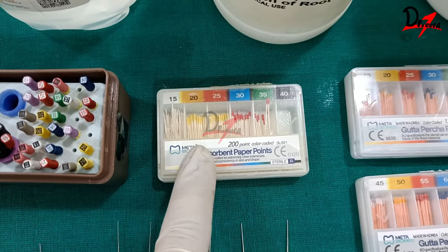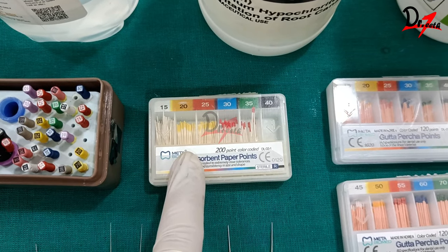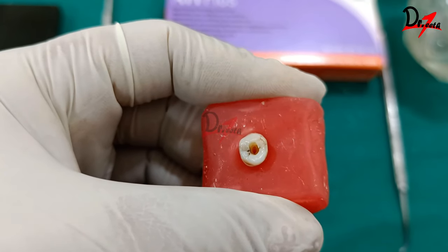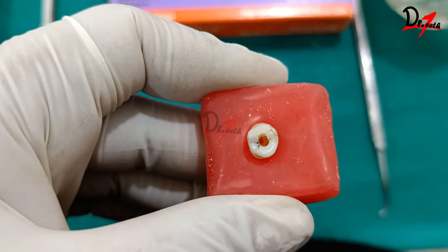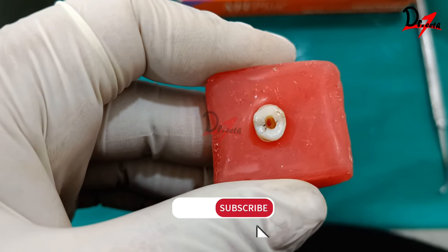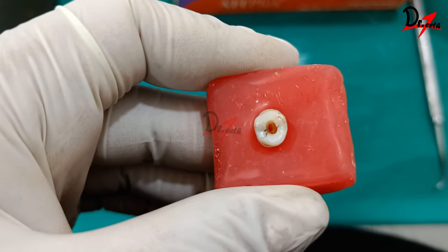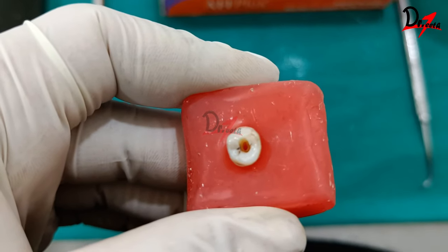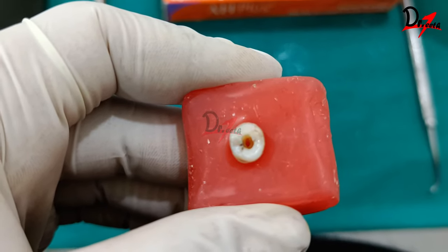After irrigation and before obturation, we need to dry the canals using absorbent paper points. Since my master apical file was #45, I'll use a #45 paper point to dry the canal. In this case, I've already done the final irrigation and dried the canal. Obturation is the method used to fill and seal a clean and shaped root canal using a root canal sealer and a core filling material, which is typically the gutta-percha cone.